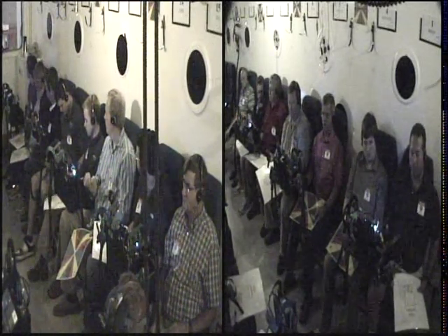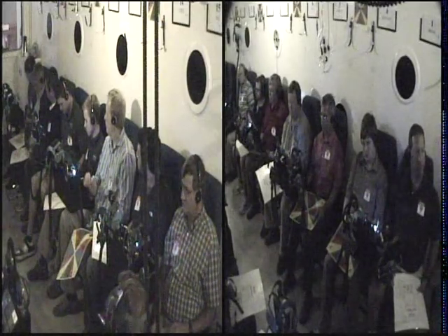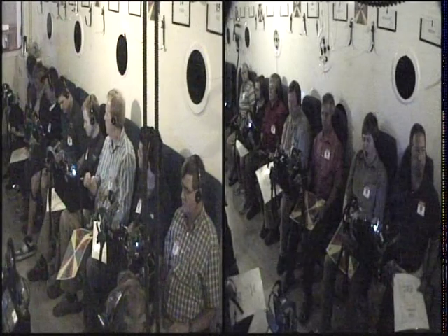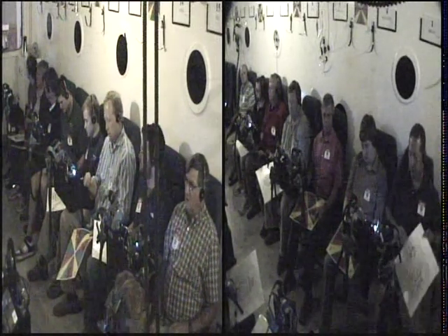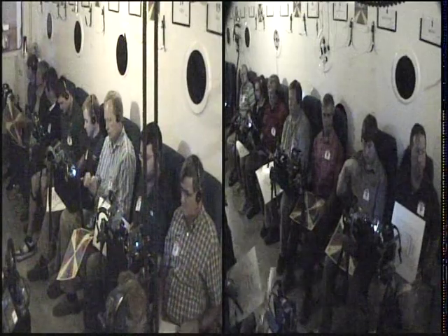Just get the mask on, but hold your breath for a couple seconds until you get the card reestablished in front of you at that normal reading distance. And then I want you to take 3 good deep breaths of oxygen and then breathe at a normal rate while focused on the card in front of you. The colored side, I'll want you to first be looking at the colored side when you bring the card up.